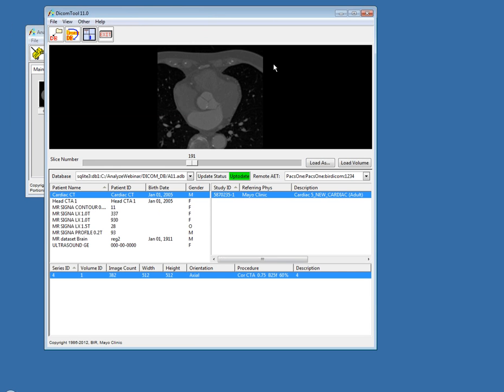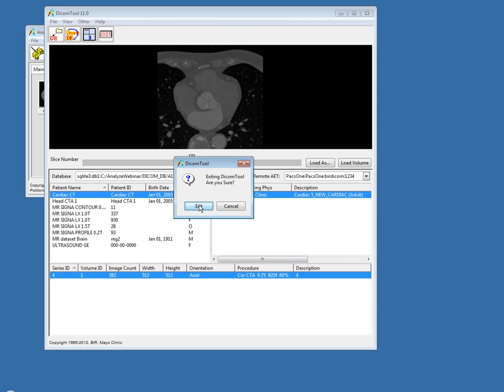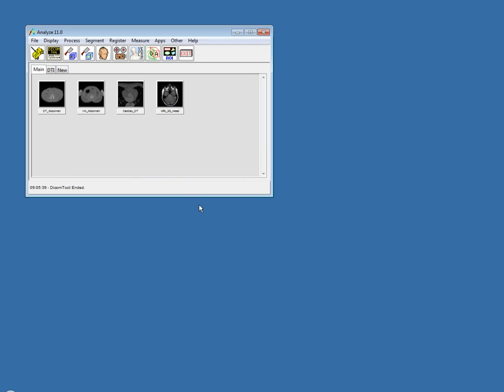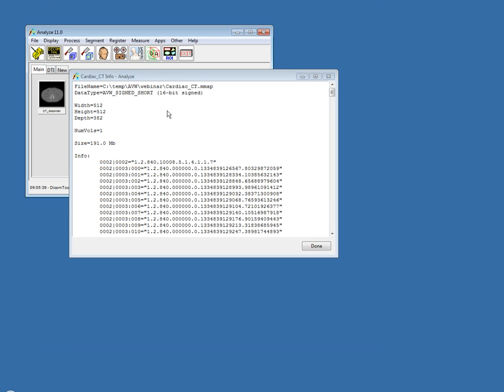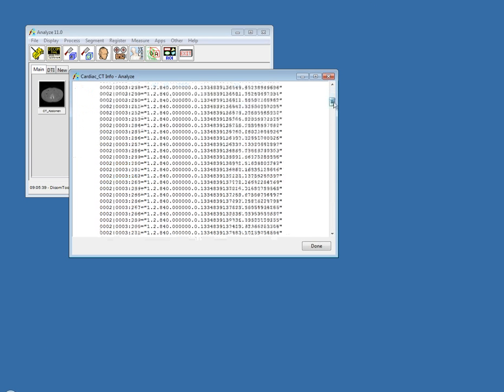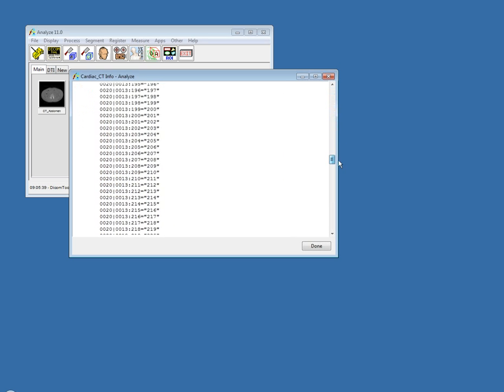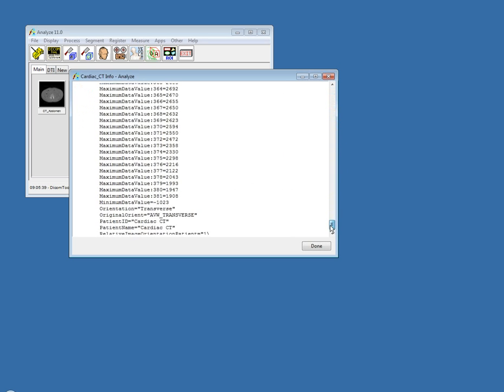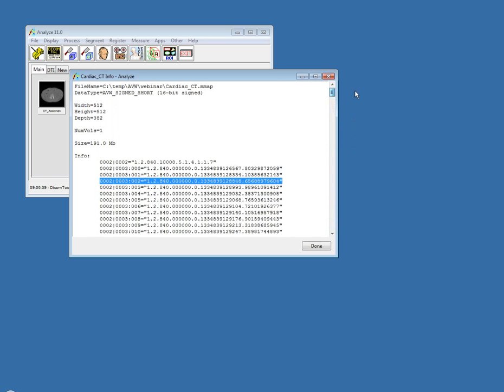An additional feature added to the DICOM tool is the maintenance of spatial location information for slices. If I exit the DICOM tool and look at the header information for a DICOM data set that I've imported, you'll see that it now tracks the spatial location of each slice in the entire series. This is useful because if you output this data set out of Analyze in DICOM format, you're going to see improved compatibility with other software.